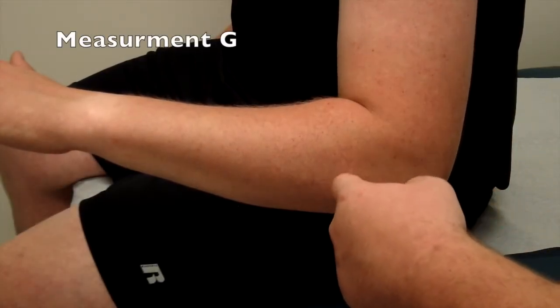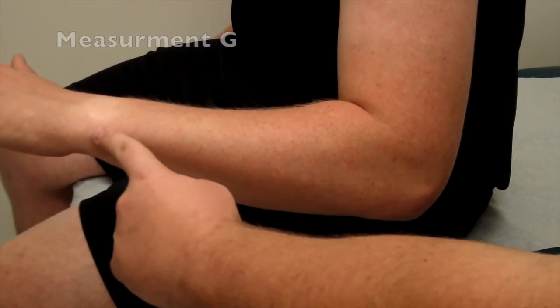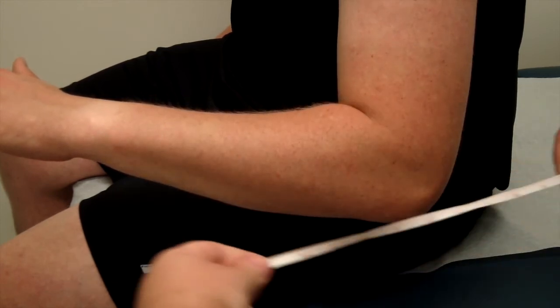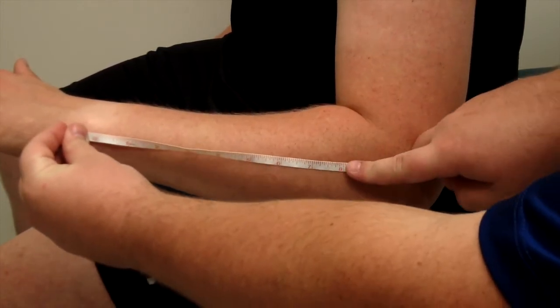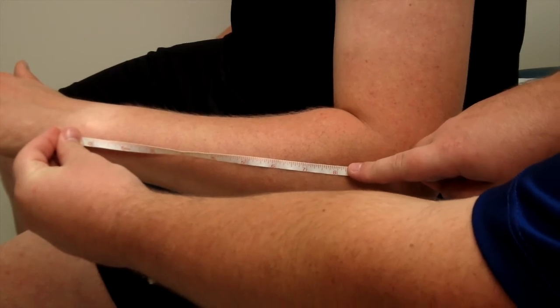Measurement G. Locate the crease on the forearm created by the contact between the bicep and forearm when the arm is flexed. Now locate the ulnar styloid. Measure the distance between these two points.